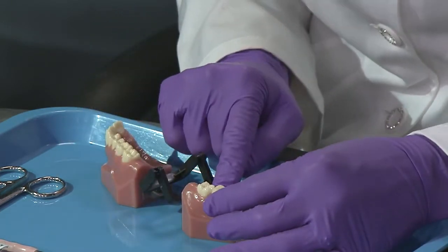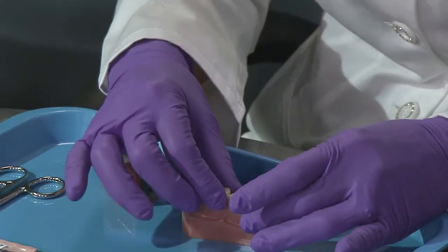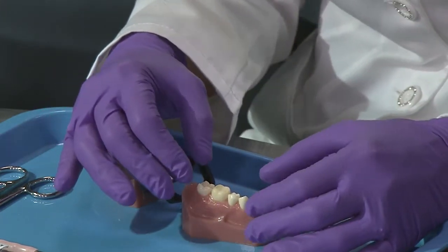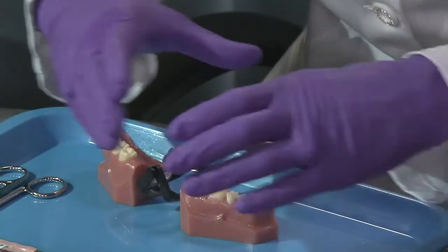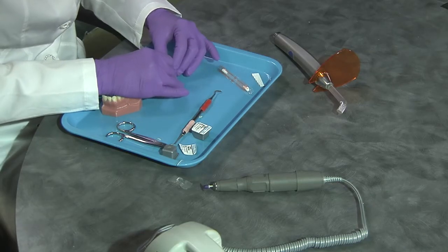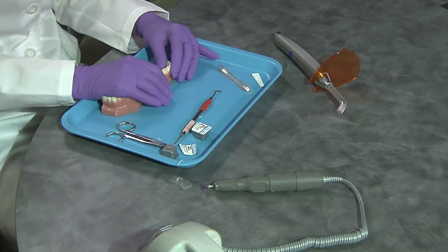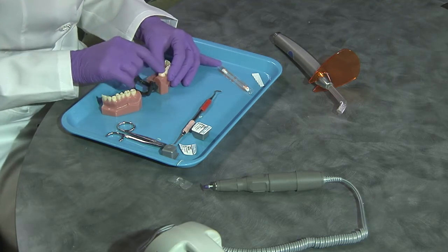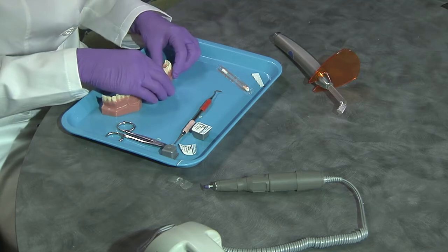It is made out of composite, so if you have contacts that are open, you can grab it and stretch it to fit the contact. Teeth don't really move, but I can stretch the material — I can grab it, mold it, and stretch it to touch the other teeth on either side. That's what I'm going to do to get my contact. Now let's talk about what if you do have an open contact — I'll share that a little bit later. Most of the time I can get it just by stretching that material, because again, it is a malleable crown.